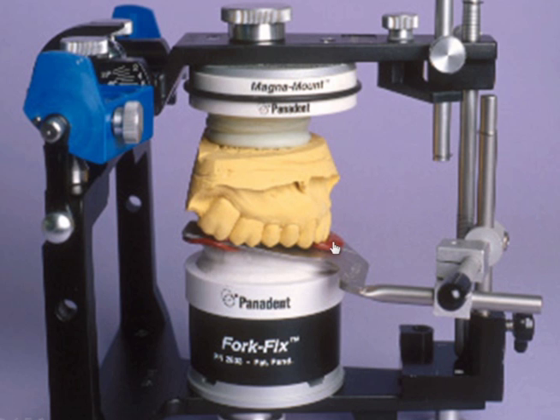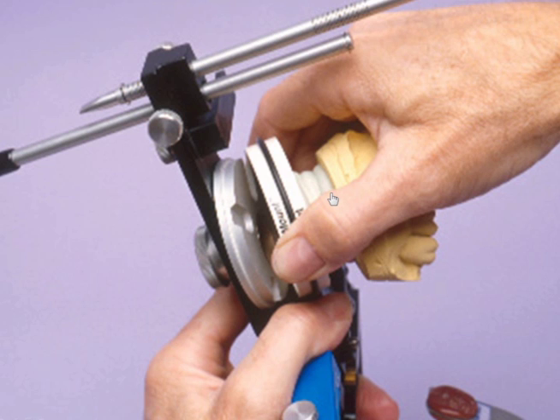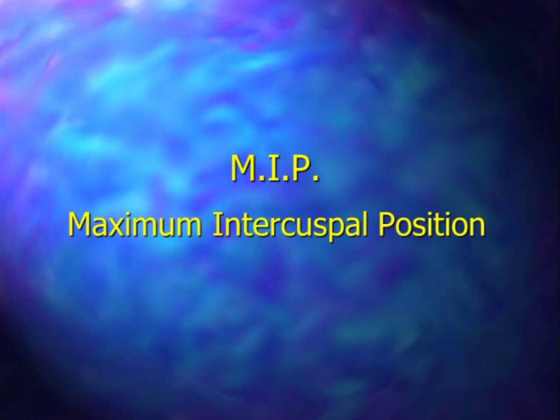So we can now see we capture the plane of occlusion as it relates to the plane of reference, connecting that cast to the upper frame. We can then open the articulator and remove the upper cast so we can mix another batch of plaster to beef this up and smooth it out to make it look really nice for patient consultations. We can then re-index that to the upper frame of the articulator.